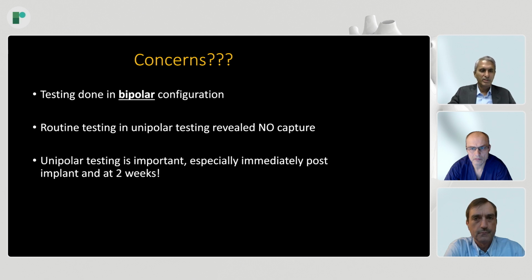Thank you for that input. And I think unipolar testing is important, and probably programming unipolar is the best way to avoid any trouble or to miss any late perforations in these patients. Next slide, please.